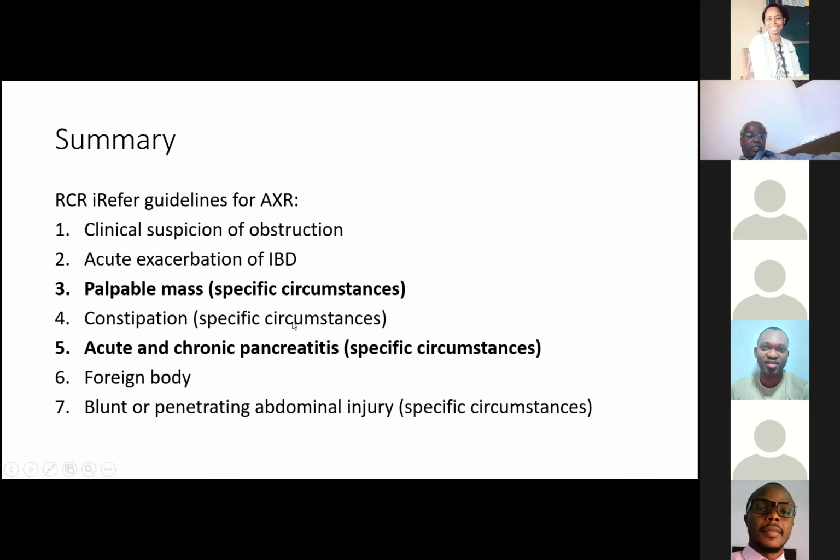I think you've partly answered a question. Well, it's not a question, it was a comment by somebody, which obviously reflects the circumstances in sub-Saharan Africa and low-income countries a lot, which is that most of our patients can't afford CTs. Mostly we base our decision on X-rays most of the time, so we'll be attentive to the details of the X-ray.